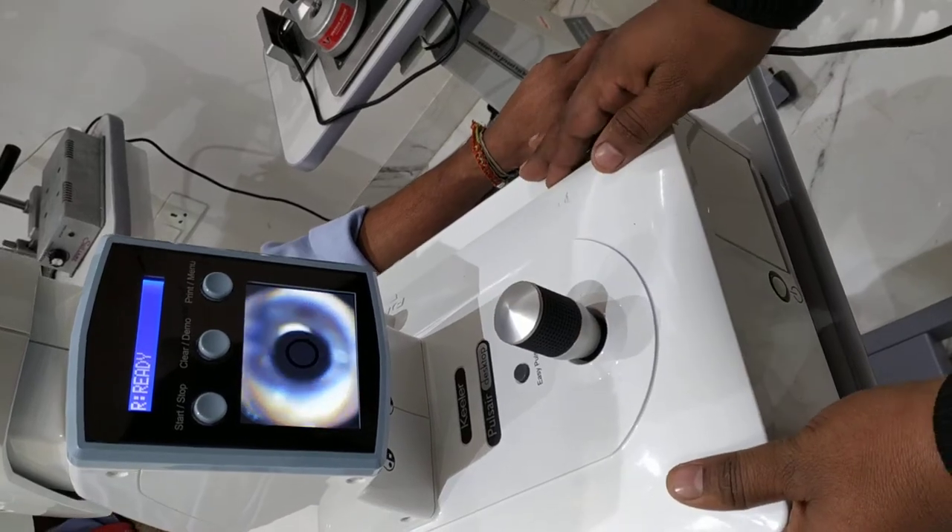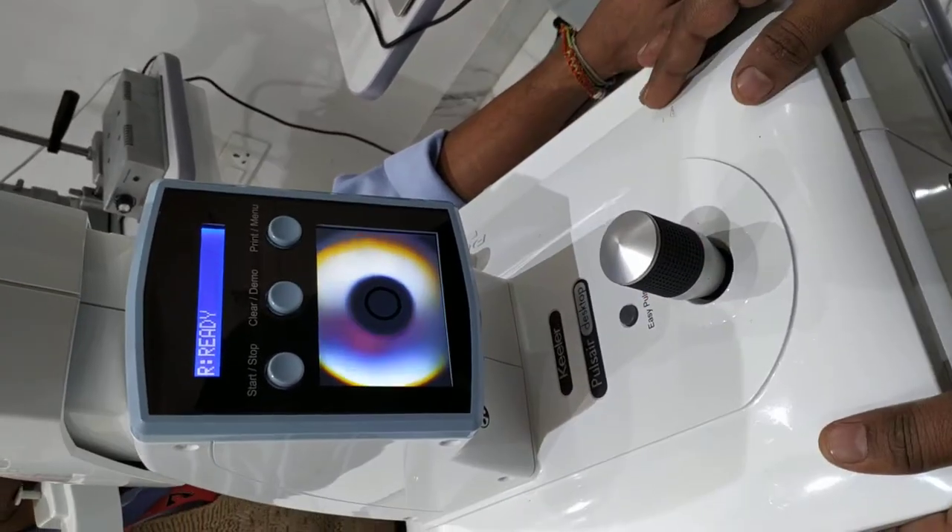So you can take the automatic data. Within seconds, you will get the data.